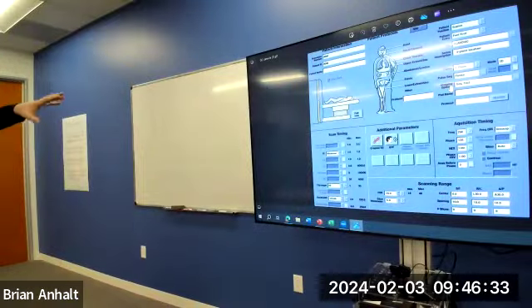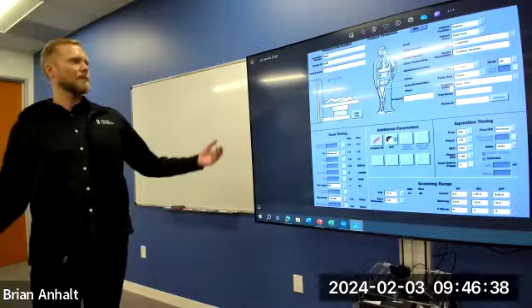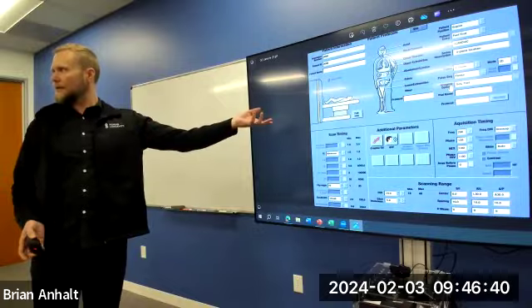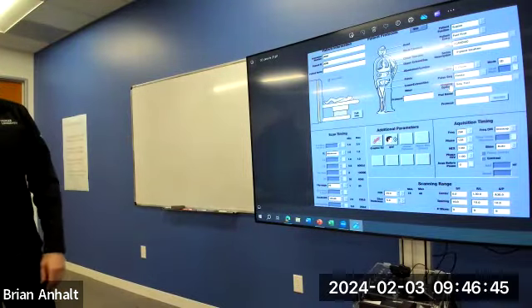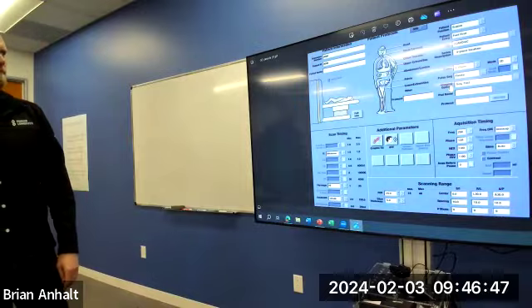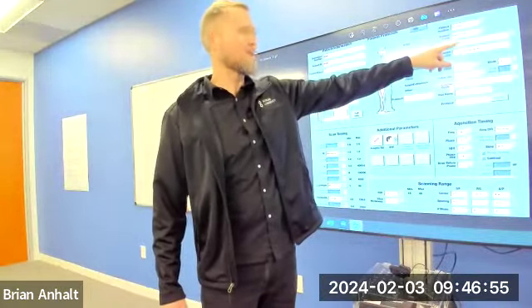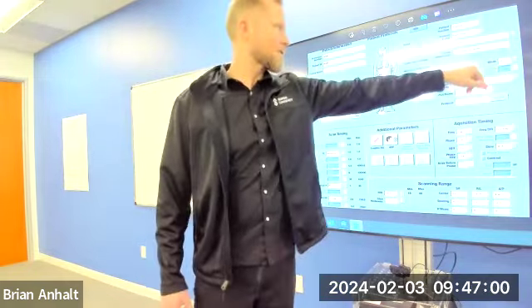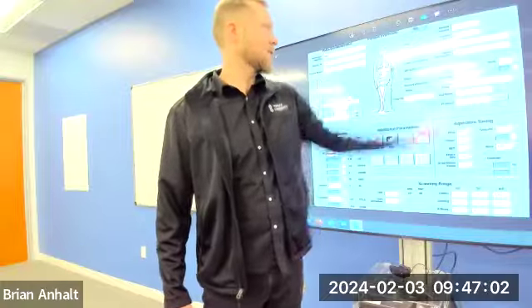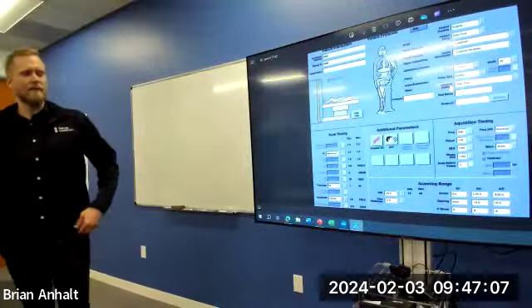So anyway, I show you this because all those things you can change and adjust, right? I'll keep going back to this when we're speaking about each one of these parameters to show you where it is, and we can do some exercises with it as well. You can also see up in here, we won't talk about this, but you can see patient position. Are they going in feet first or head first? The coil that you're using, series description, 2D versus 3D, planes, the pulse sequence type, patient session number, patient ID, all that good stuff.